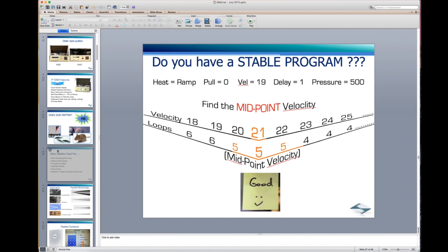Now, when you're putting a spike on the pipette, you're putting a little splinter, a sword of glass, on the tip of the pipette. And when you do that, you're using your microforge and heating up the tip and yanking the pipette away from the heated filament. You're making this little spike of glass on the end. If your heat's too high, you're going to melt that glass down a little bit, and the sperm are more likely to stick to the tip of the pipette.